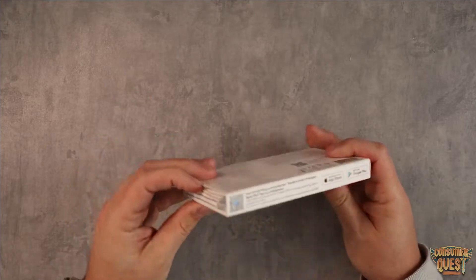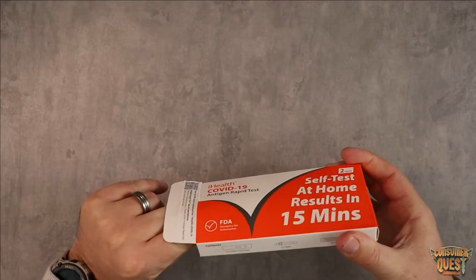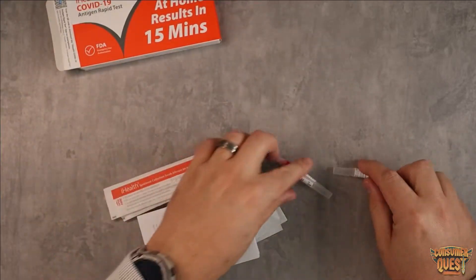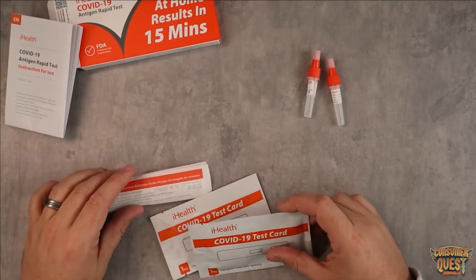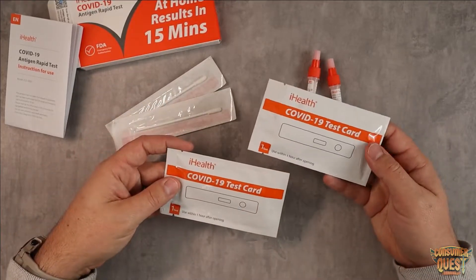First things first, you're going to open up the package and get everything out. Inside each one of these, you're going to find two test kits. So one box is going to give you two, which is fantastic. You've got your solution bottles, your instruction manual, which will tell you all the stuff I'm about to tell you, two swabs, and two testing cards.